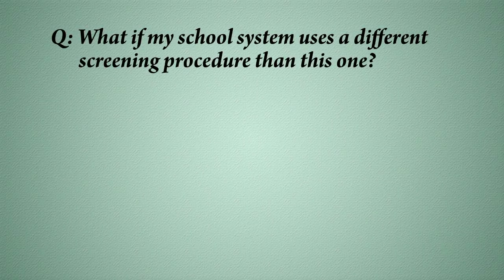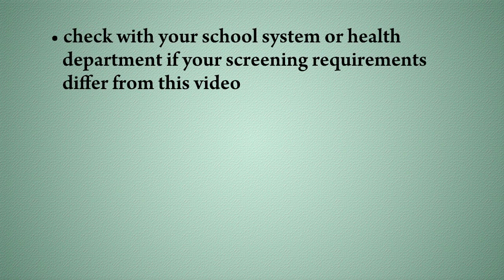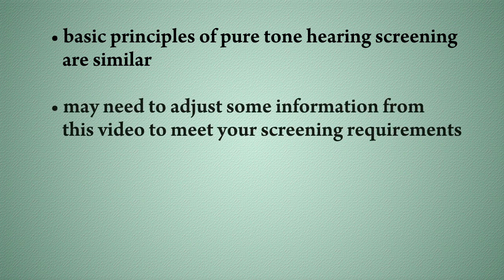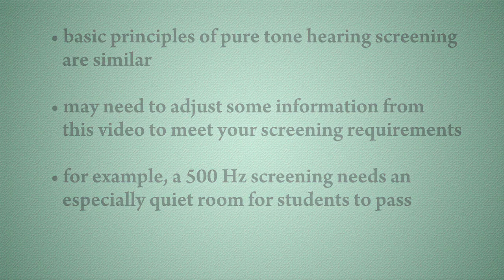What if my school system uses a different screening procedure than this one? This video is based on ASHA 1997 guidelines. However, even if your school system does not follow these guidelines, the basic principles of pure tone hearing screening are similar. You may have to adjust some of the information from this video to meet the screening requirements of your school system. For example, if your school system includes 500 Hz for screening, you need an especially quiet room, otherwise this frequency will be missed by many children with normal hearing.